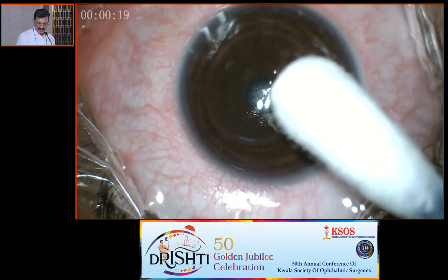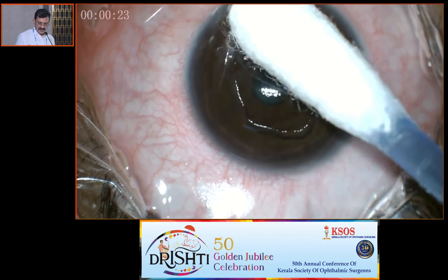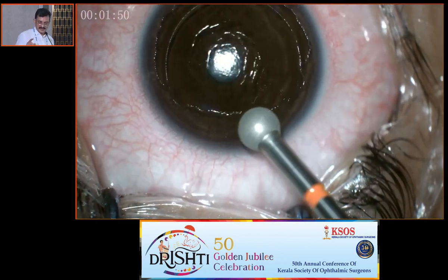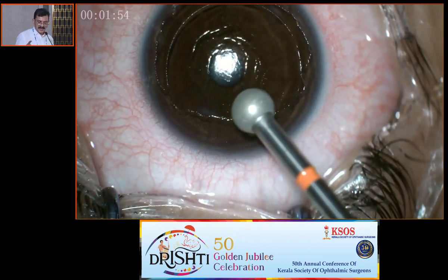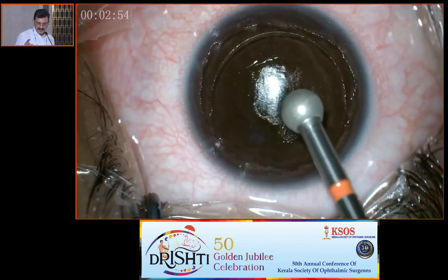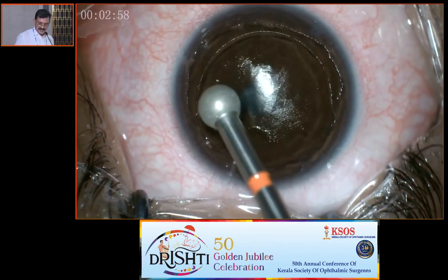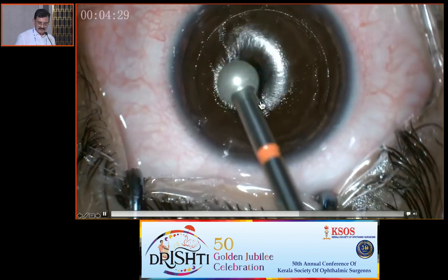For example, this patient is a bit complicated, right, involving the pupillary area, and it's a post-LASIK case. She got operated for LASIK for marriage, and she had to postpone her marriage because she was not able to open her eyes. So after 3 months she came to us. There are microfolds, everything will disappear. You can see the LASIK flap here. No need to worry at all, absolutely.